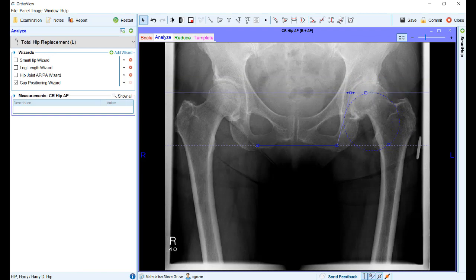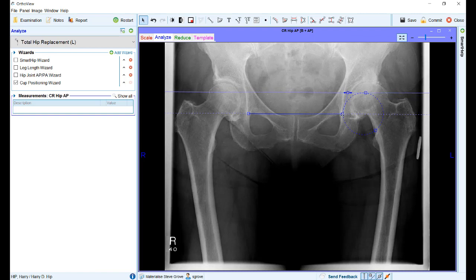To begin, drag the handles as shown to mark the teardrops on each side of the pelvis. Next, using the third handle, mark the medial wall of the acetabular socket. Then with the handle on the top of the circle, mark the superior point of the acetabular socket, and finally with the second mark on the circle, outline the acetabular socket.